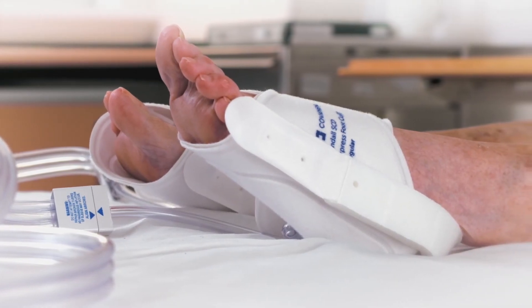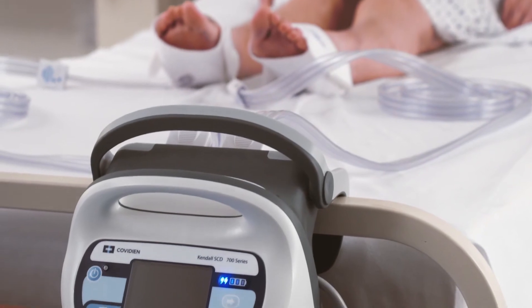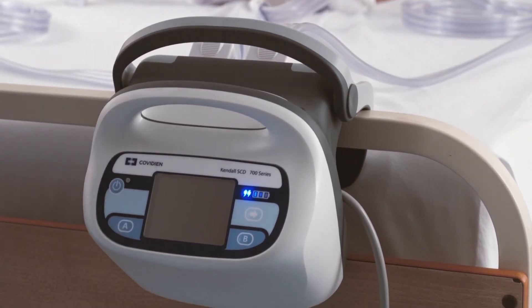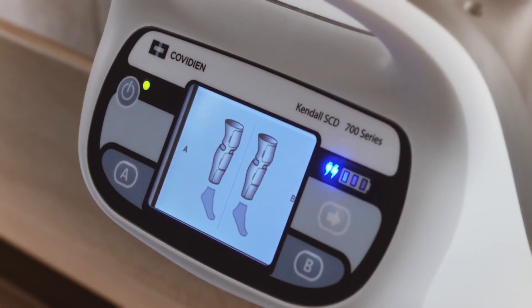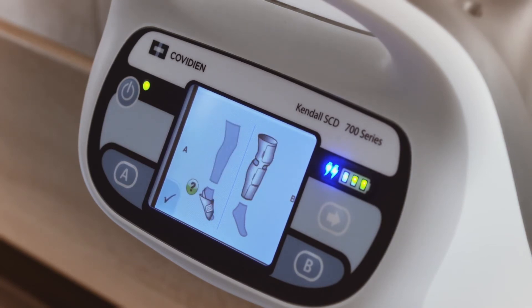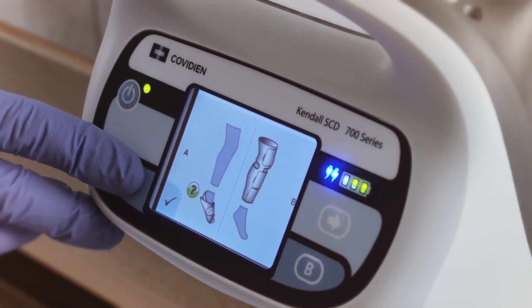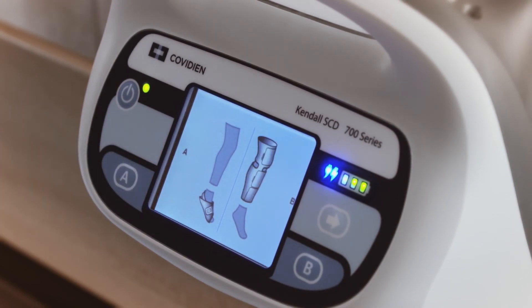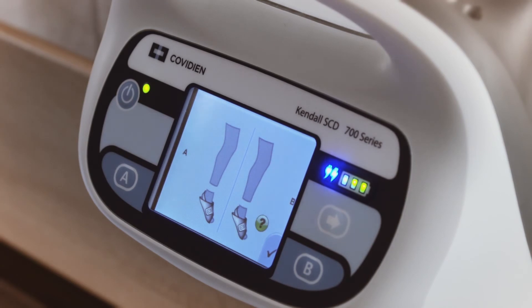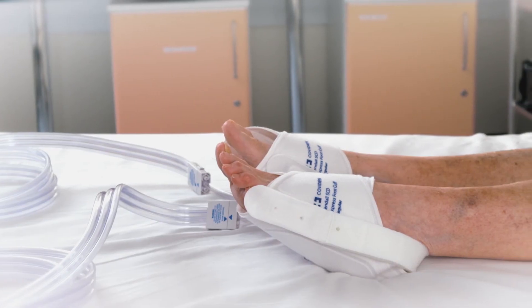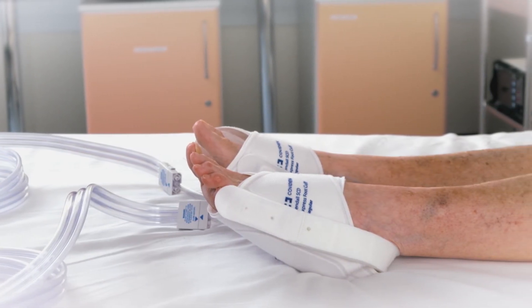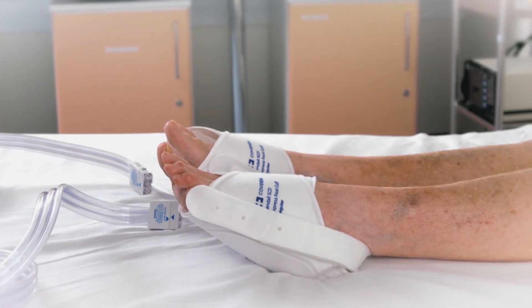If a Kendall SCD Express foot cuff is being used, the user must indicate this during the garment verification procedure at the start of therapy. During start-up, the port A and port B leg images will blink to indicate the default garment configuration, which is leg compression. Pressing the A and/or B buttons will cause the corresponding port's leg image to shift to a foot image, indicating that foot compression is desired. This selection will be confirmed and foot compression will commence once a solid foot icon appears on screen.